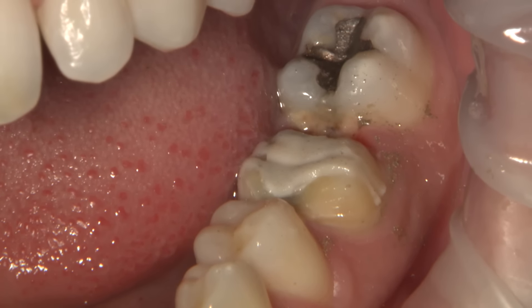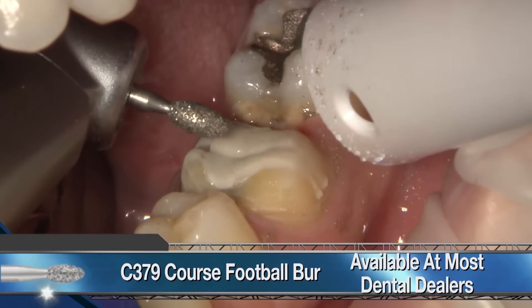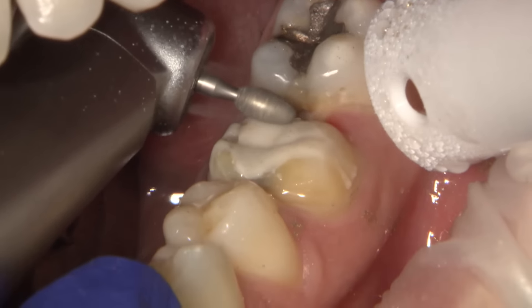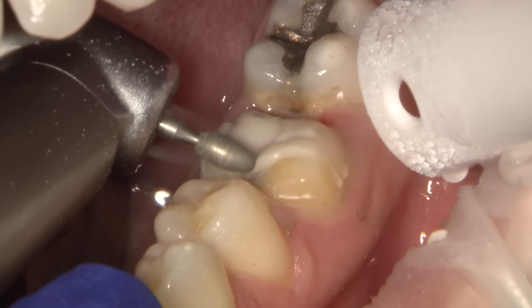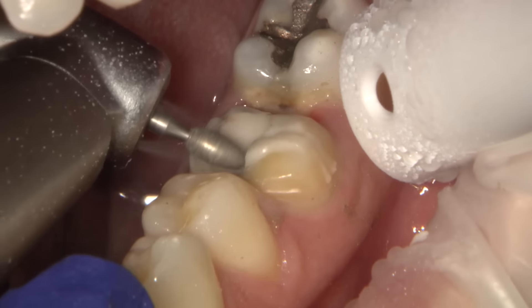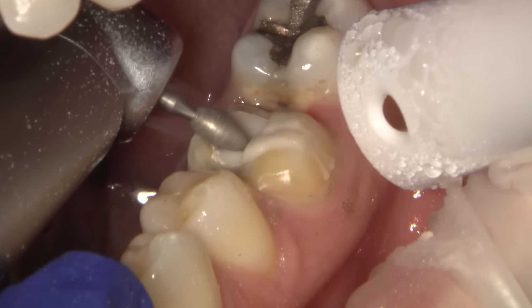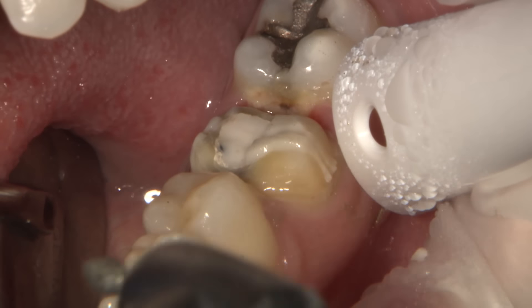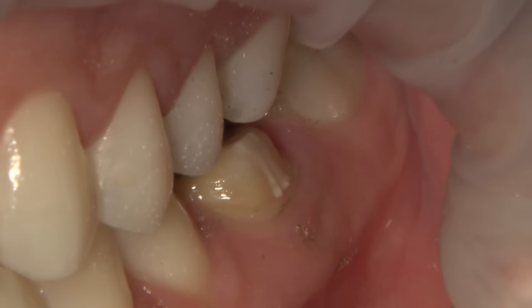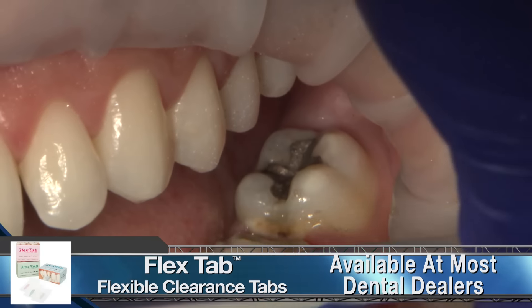The crown can then be removed with a crown removal tool using a gentle twisting action. Once the crown is removed, I then begin refining the prep. I typically start off on the occlusal surface with a coarse football diamond bur. Some of the previous luting cement beneath the old PFM is still on the tooth. Sufficient occlusal reduction of one and a half to two millimeters is going to allow for adequate material thickness of the new restoration, as well as create space for proper natural inclines on the occlusal table. If you've ever received crowns lacking occlusal anatomy with a flat appearance, it's most likely due to an inadequate reduction in the center of the prep.